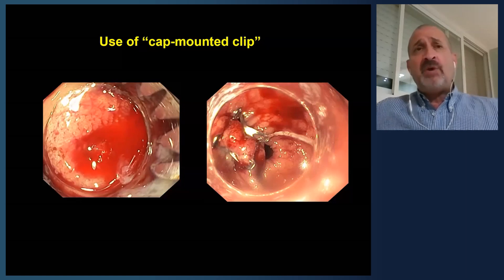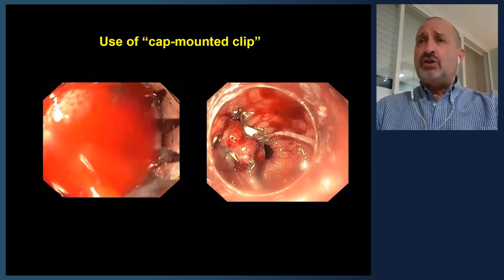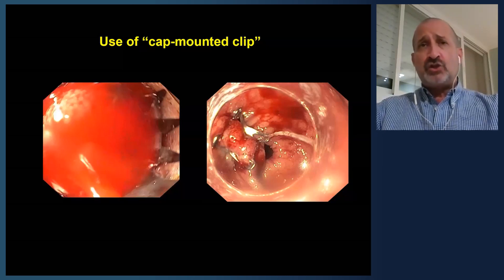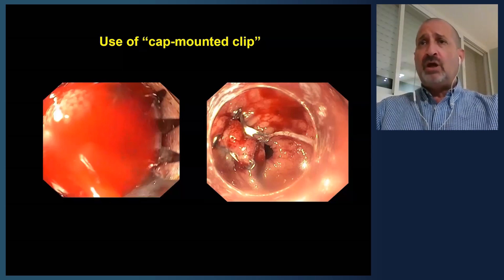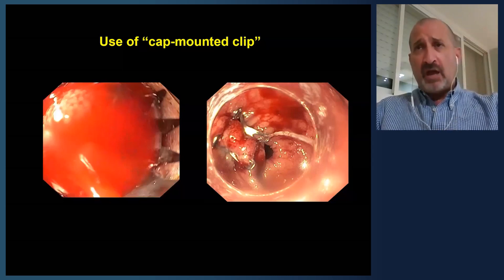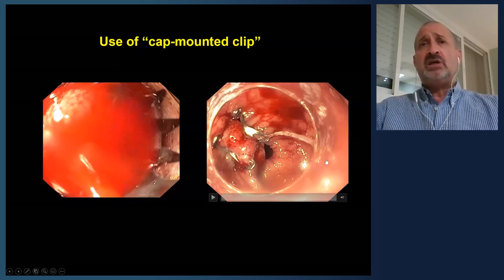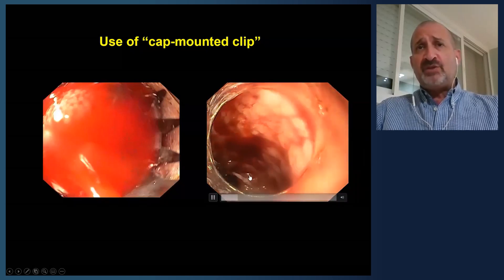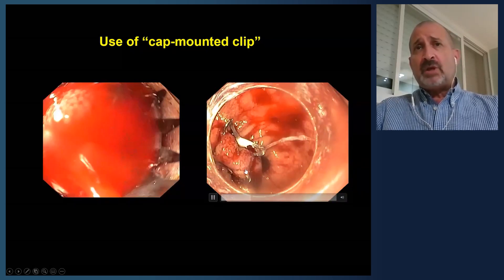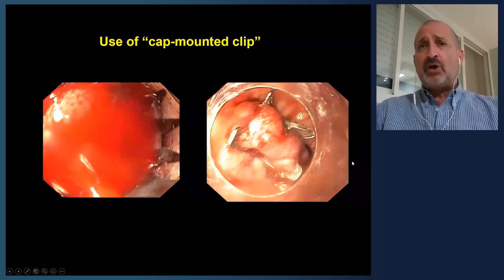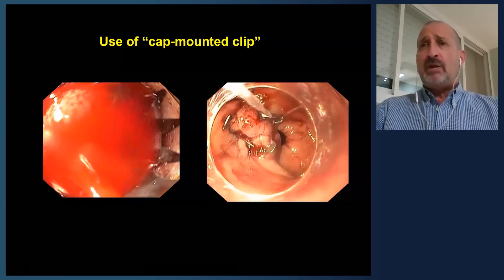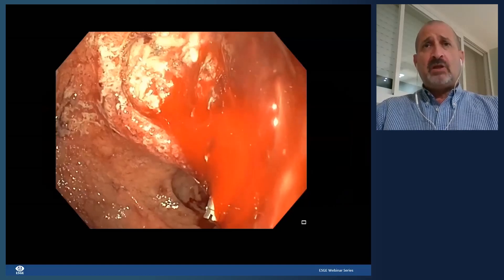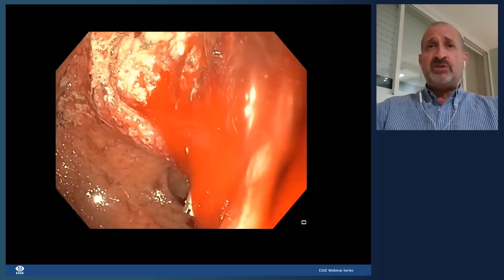On the left is an actively bleeding pre-pyloric lesion — pulsatile, not spurting — so injection was not used. The plastic cap is placed right over the bleeding site, the tissue is suctioned into the cap or grasped and pulled back, and then the clip is released. Afterwards, you can see the clip has been placed over the bleeding site — no bleeding — it grabs a large amount of tissue and mechanically presses the vasculature closed.